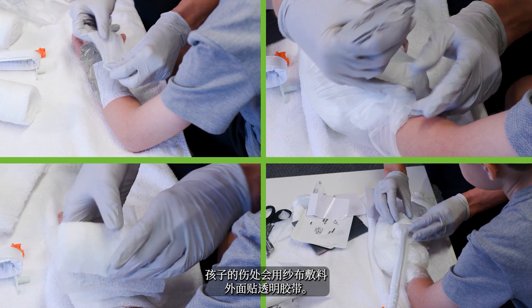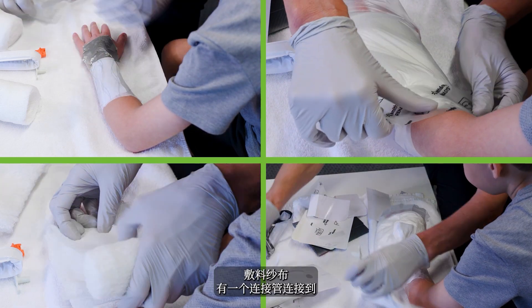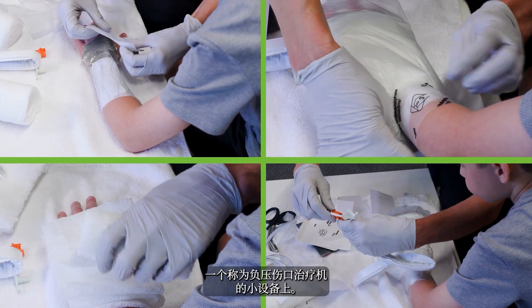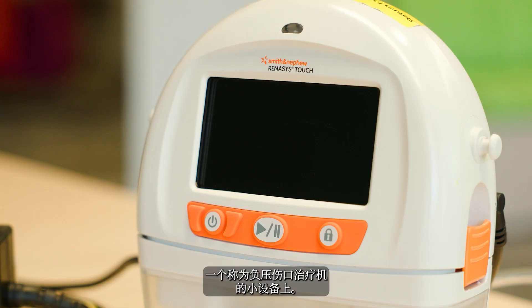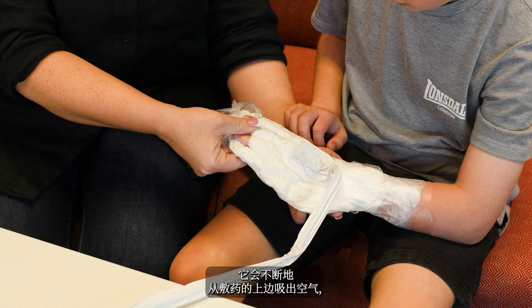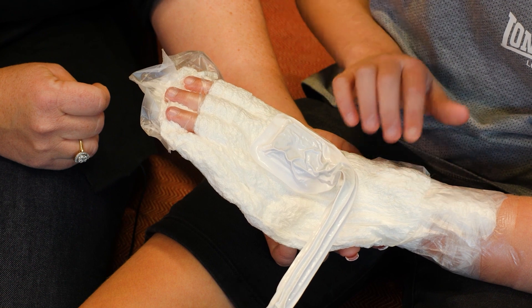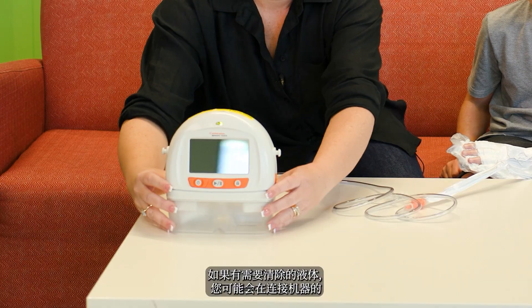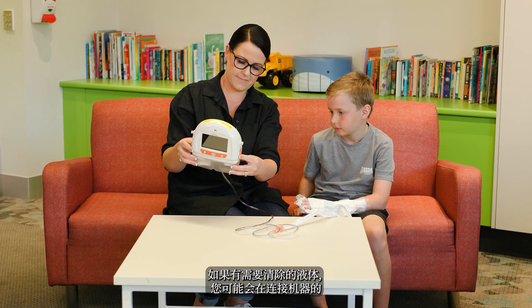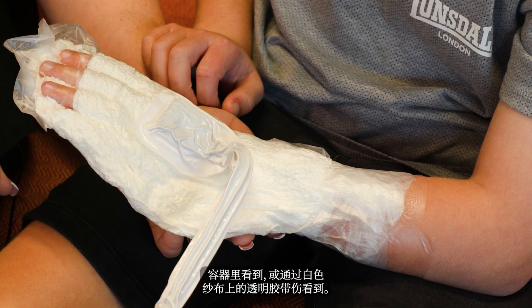Your child will have a gauze dressing covered by a clear film tape. There is a tube that connects from the dressing and attaches to a small device known as a negative pressure wound therapy machine. This continuously sucks the air from the top of the dressing, making it feel hard to touch. If there is fluid to be removed, you may see it in the canister attached to the machine or through the clear film on the white gauze.